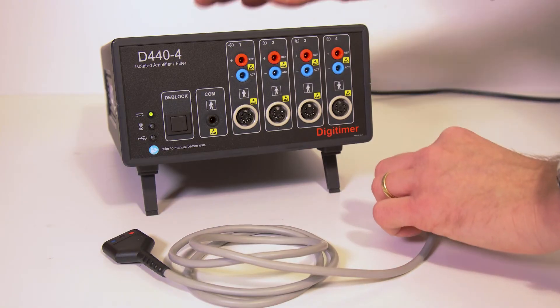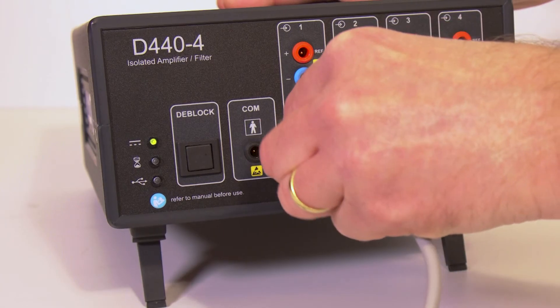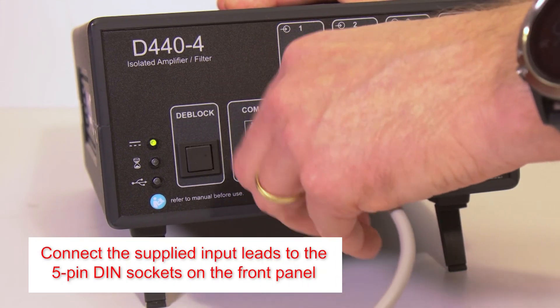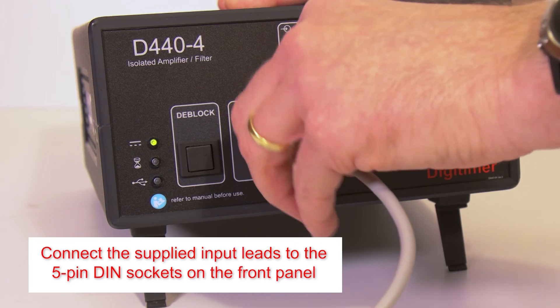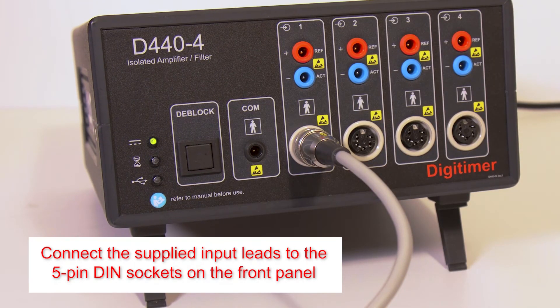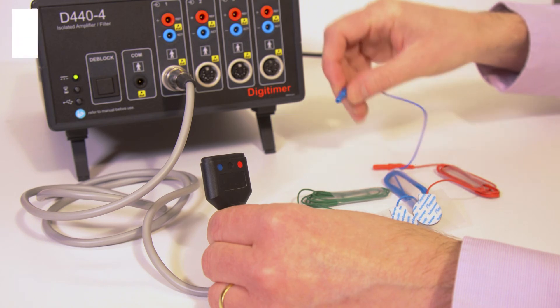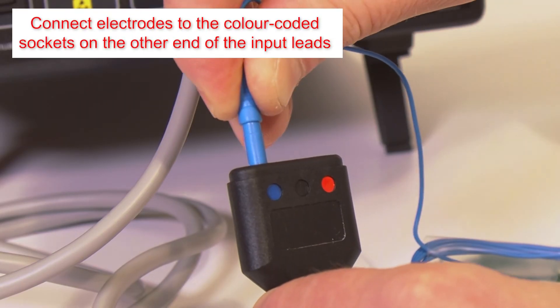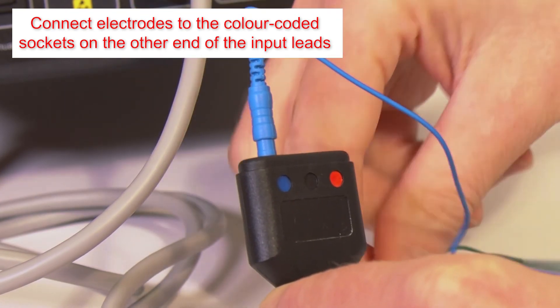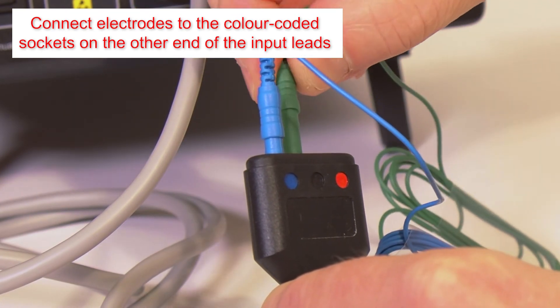Each D440 amplifier is supplied with an appropriate number of shielded input leads, terminating with three 1.5 mm electrode connection sockets. These leads connect to the D440 via the 5-pin DIN sockets on the front panel. Electrode lead wires should be connected to the colour-coded sockets on the other end of the shielded lead, taking care to ensure the plugs are fully inserted.